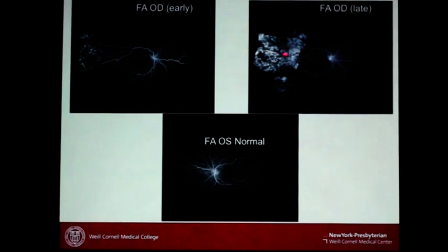Right now, what I do is I go into my OR. If you have the ability to do this, I bring my computer, right? I put the images up on a screen. If you have one of those Thunderbolt drives, those displays, those are nice. They're like $1,000. But you put it up on your screen, and then you can actually look at the image while you're doing the laser, right? I find this very, very useful.